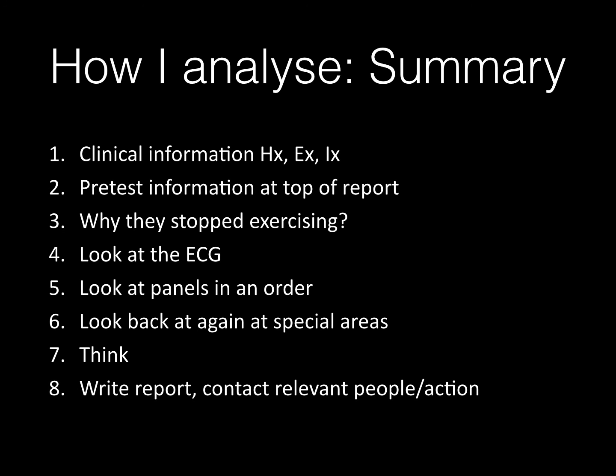Then we will give recommendations as to what should happen as a result of the cardiopulmonary exercise test to our surgical colleagues. Of course, if you want to know more, I'd suggest you get in touch with your cardiopulmonary exercise team wherever you are, and perhaps even do a test yourself.